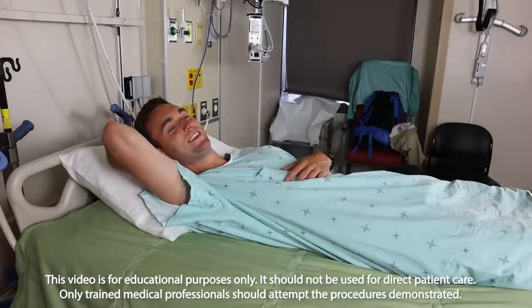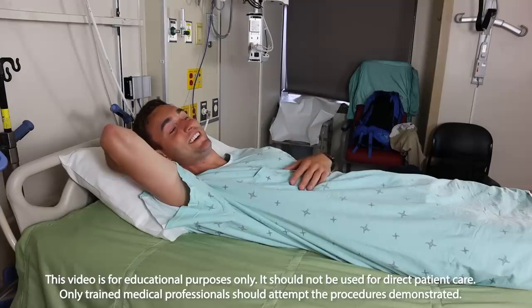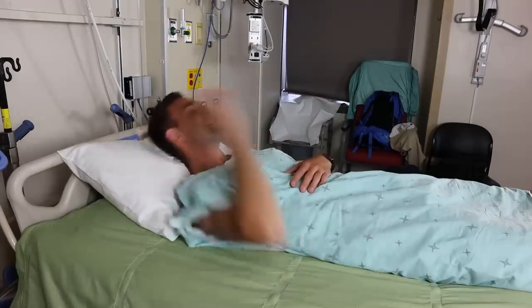Today, Dr. Frankel will be the model for the right internal jugular central line. It's probably the one you're most likely to do, but stick around because we do discuss the other common sites.